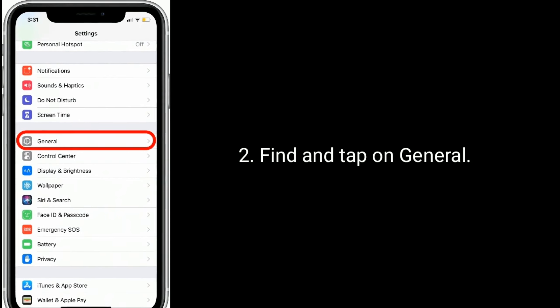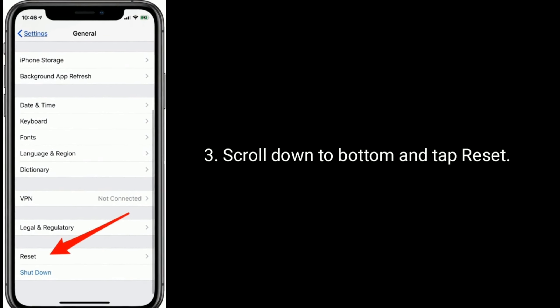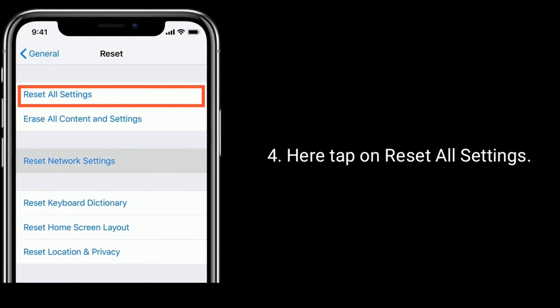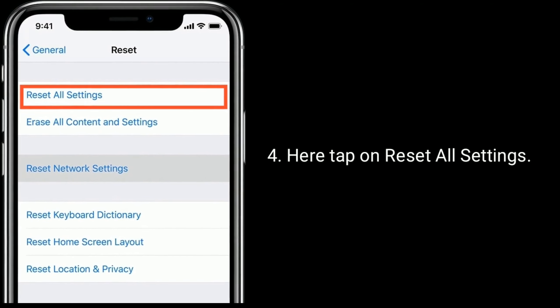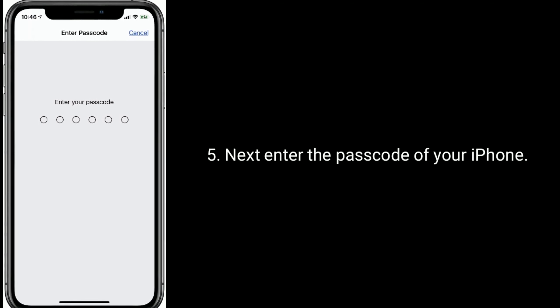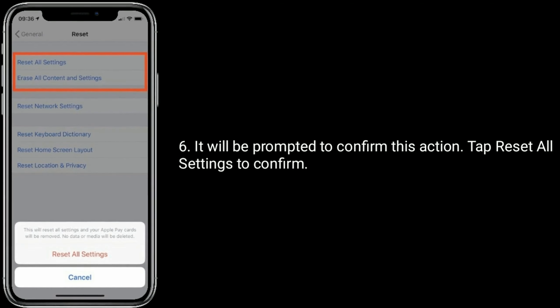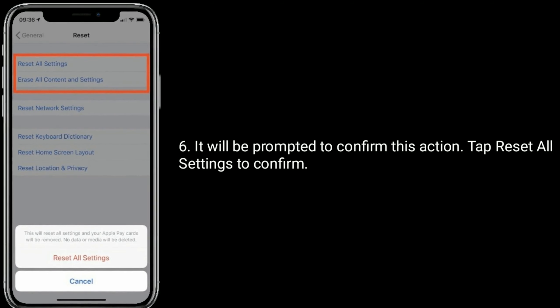Find and tap on General. Scroll down to the bottom and tap Reset. Tap on Reset All Settings. Next, enter the passcode of your iPhone. You will be prompted to confirm this action — tap Reset All Settings to confirm.